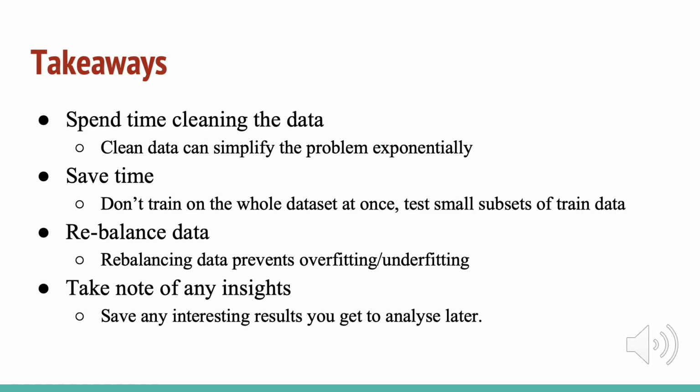So the takeaways from this were that it's definitely worth spending time cleaning the data, and to save time, don't run the whole dataset at once, but test small subsets of training data. Rebalancing the data prevents overfitting and underfitting, and take note of any interesting insights to analyze later.